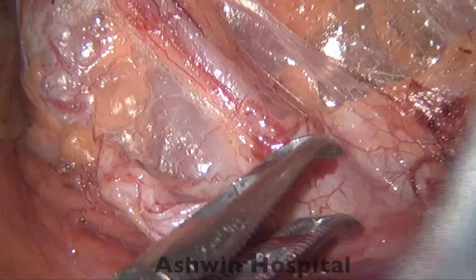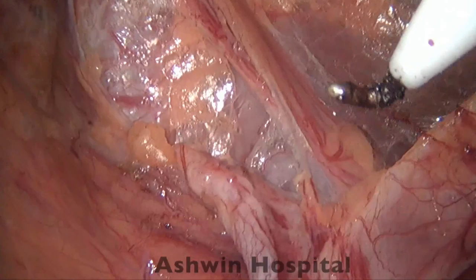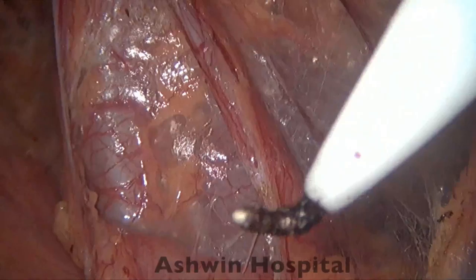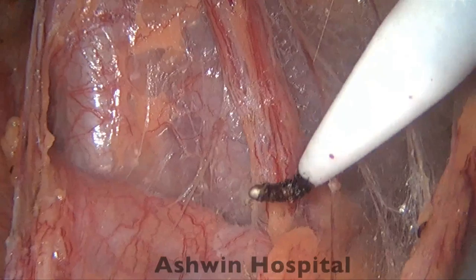And now you can see we have done a good parietalization. Just a little more is required on the lateral aspect, and if we do that, the parietalization is complete and we'll be ready to place the mesh very nicely over here. So now you can see how well the peritoneum has been mobilized away from the cord structures and also from the sidewall of the pelvis.